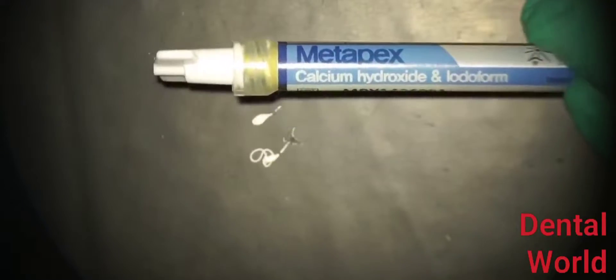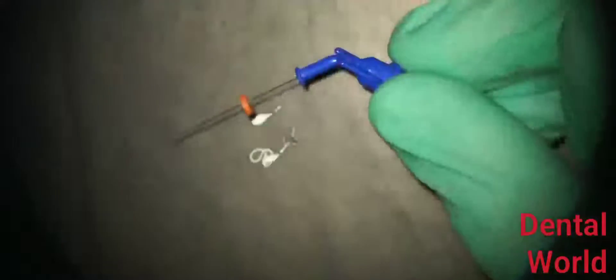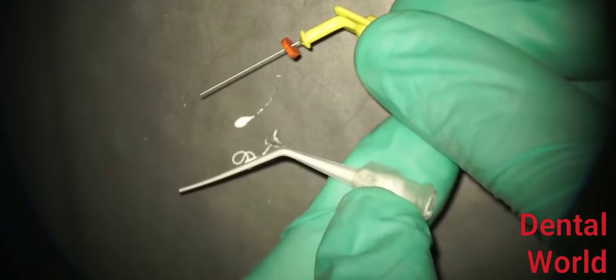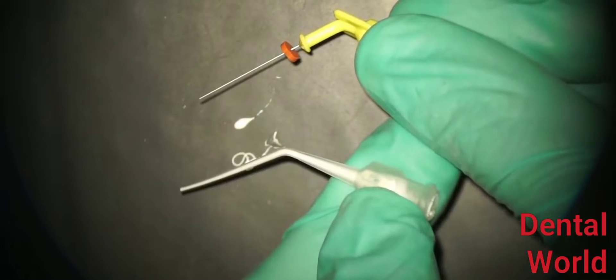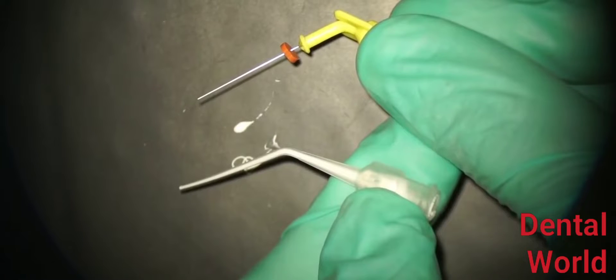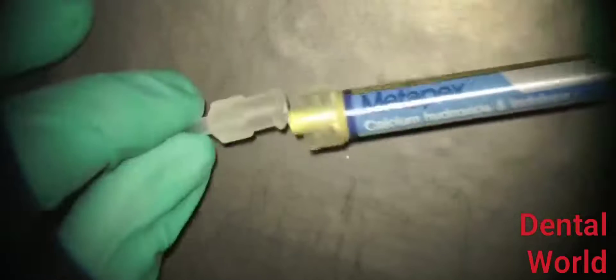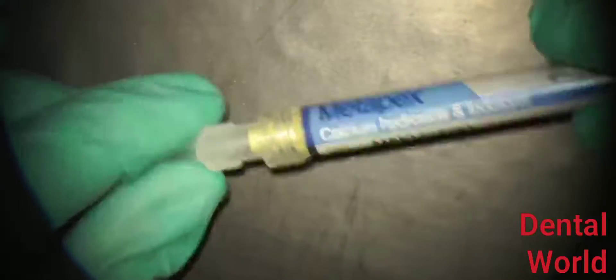Metapex, the thicker version — calcium hydroxide mixed with Iodoform — cannot be injected through the Navi tips. If you compare the Navi tip on top with the plastic tip below, you can see the plastic tip is much bigger than the Navi tip. The Navi tips are too small to inject the Iodoform-mixed calcium hydroxide. For Metapex, we use the bigger plastic tips. You can see the Metapex is much thicker and how slowly it flows.